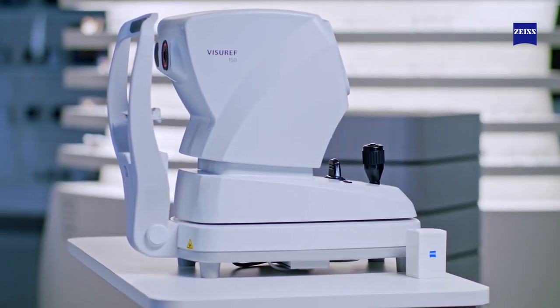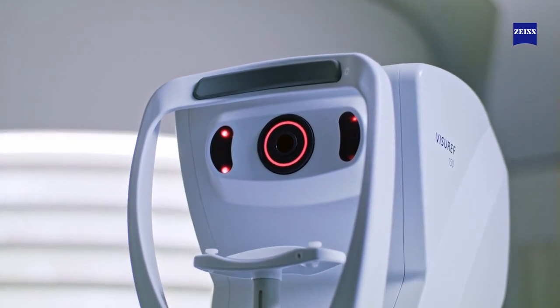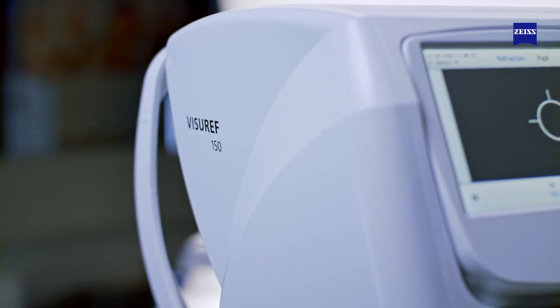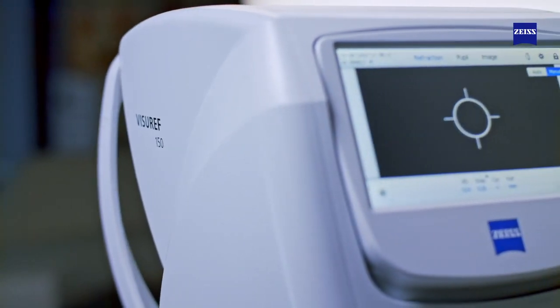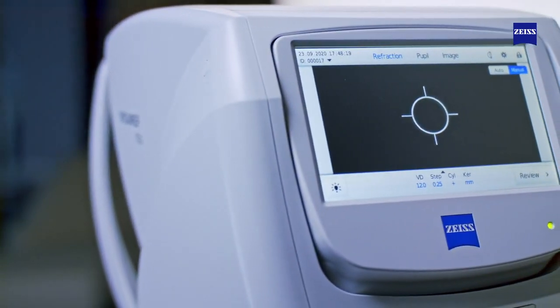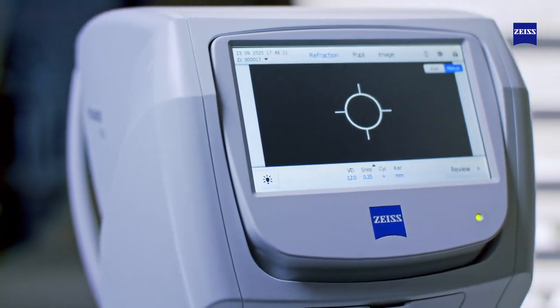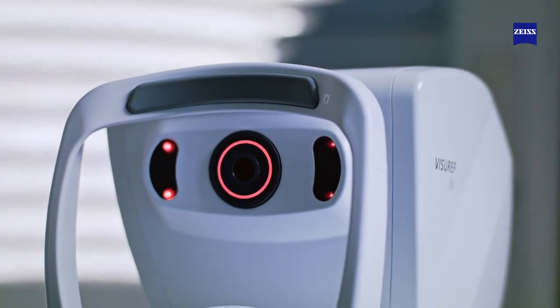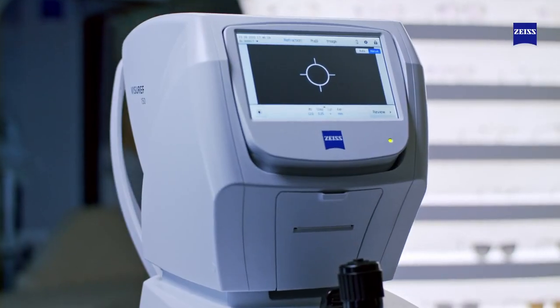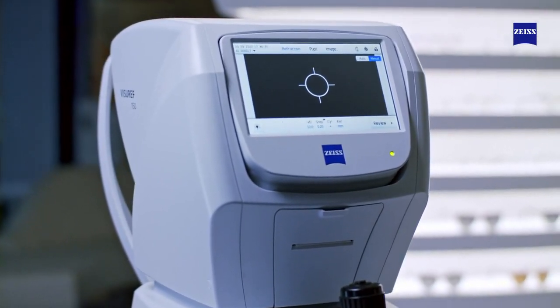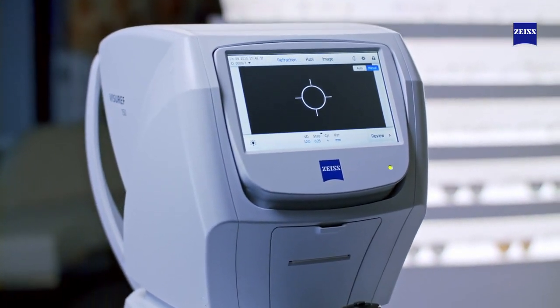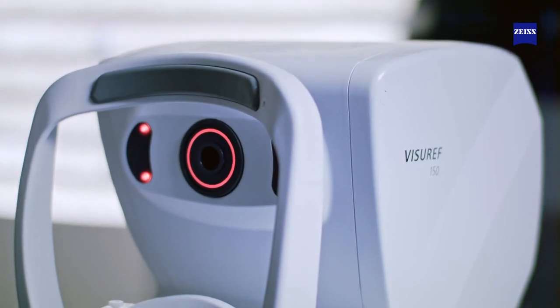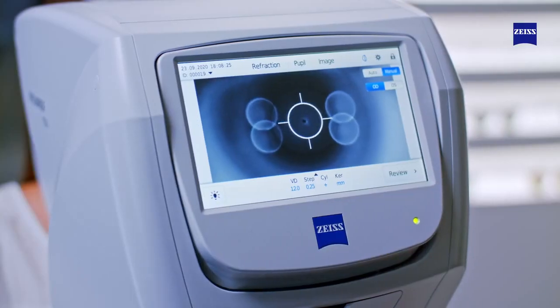Zeiss Visu REF 150 — turning precision into reliable refraction. All the processes in your practice work best when your daily workflows go as smoothly as possible. A high patient throughput in this area is key for the success of every eye care facility, as is the dependability of pretest results and patient comfort. This is exactly why we have developed the Zeiss Visu REF 150.